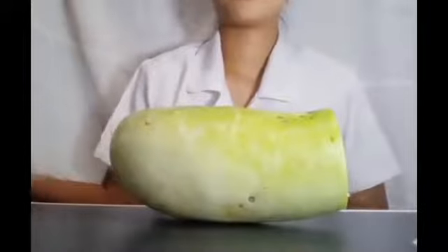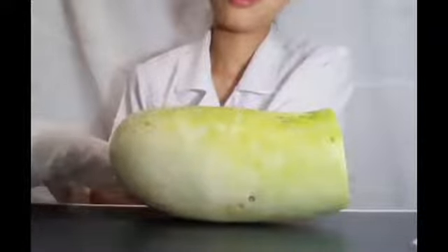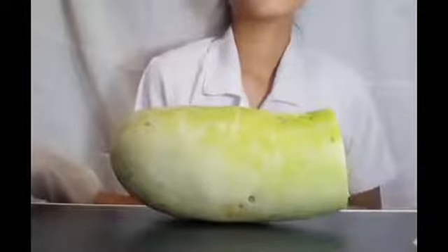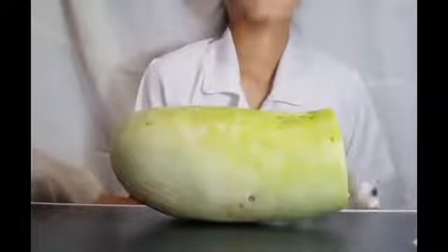Then we're going to take our syringe and we're going to inject. Remember, we will go barely above the surface, at a 5-degree to 15-degree angle.